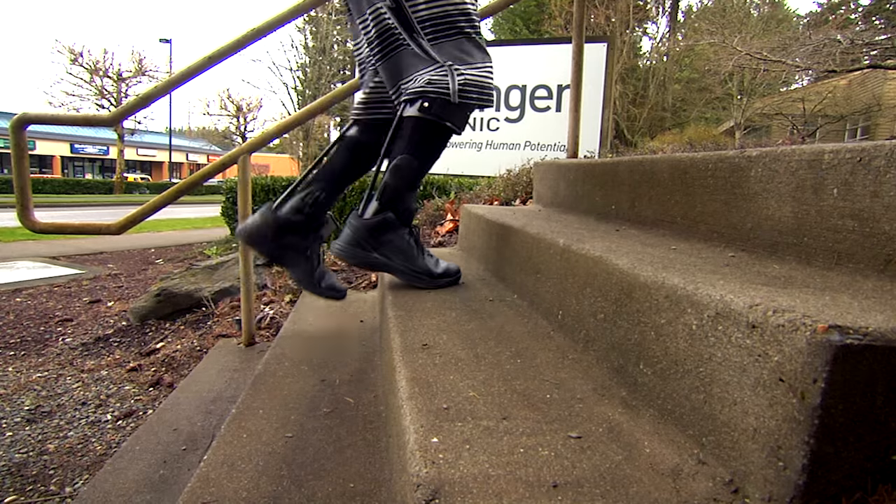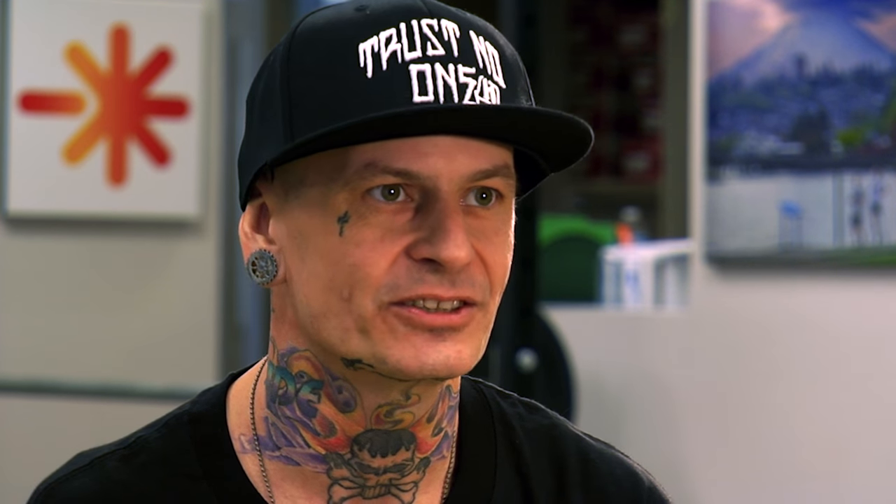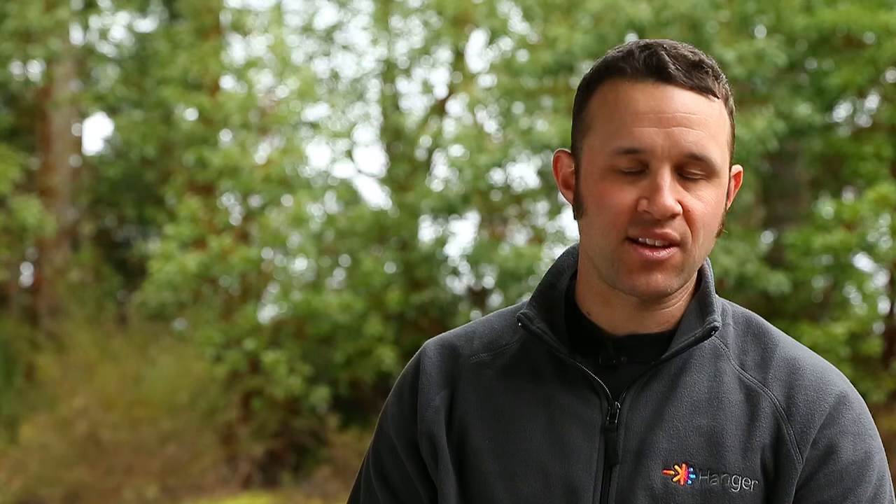I went from not being able to walk long distances to walking. I went from not being able to run to running again with no pain because of these Exosims. This is a go-far, go-fast device. It takes longer to tie my shoes than it takes to put the device on.